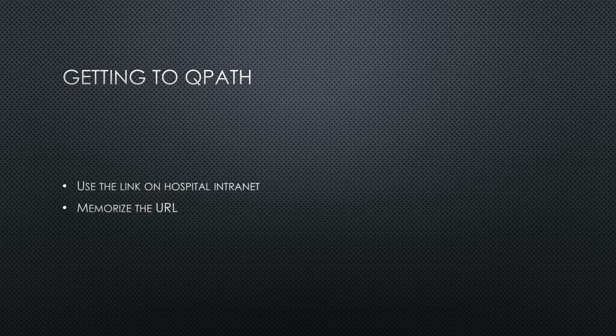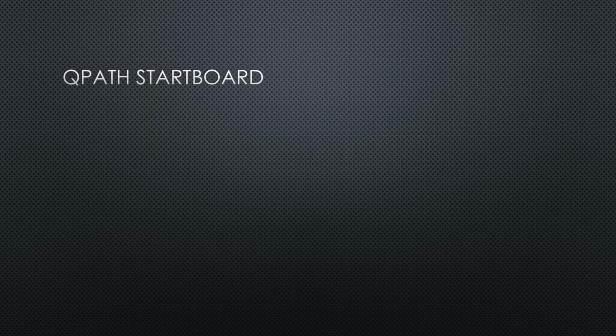So how to get to QPath, you guys should all know how. You can use the link on the hospital intranet, memorize the URL, or make an M-modal shortcut. Most of you guys I've set up with an M-modal shortcut. I'm obviously not going to put the URL on a publicly accessible video that's going out on the internet. But if you guys need it, reach out to me and I can help you make that happen.